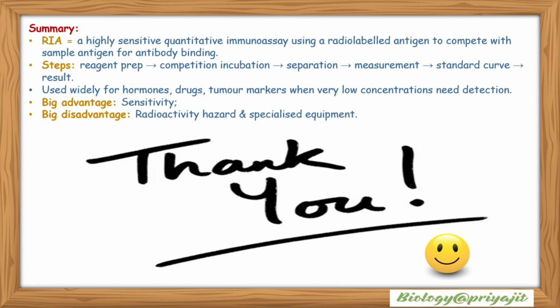So my dear students, today we explored how radioimmunoassay helps detect hormones with remarkable precision using the principle of competitive binding between labeled and unlabeled hormones. We saw how radioactivity is inversely proportional to hormone concentration and how it is applied to measure insulin, thyroxine, cortisol, testosterone, and HCG. Though highly sensitive, it requires caution due to radioactive materials.